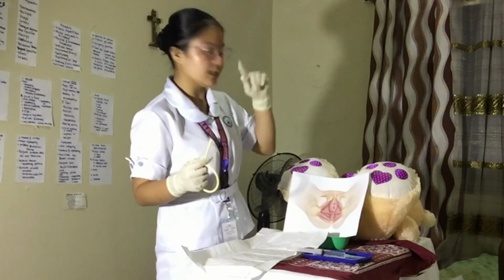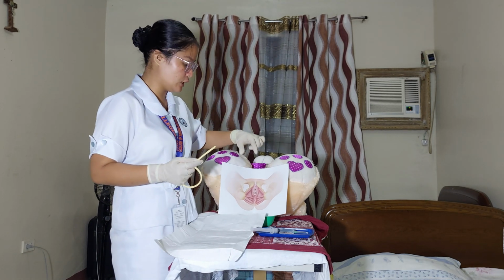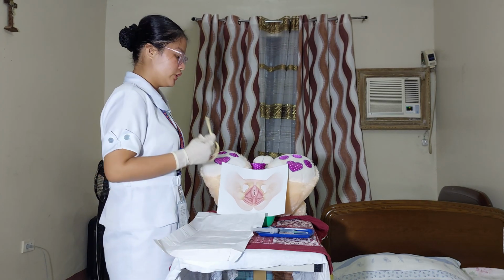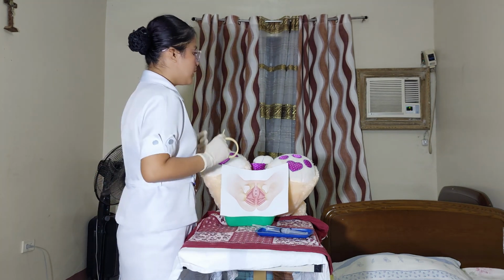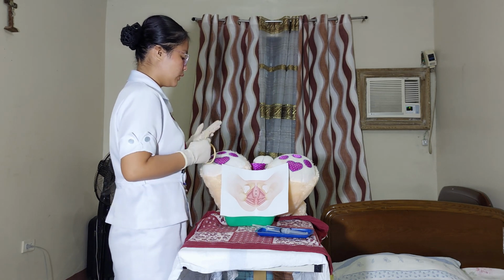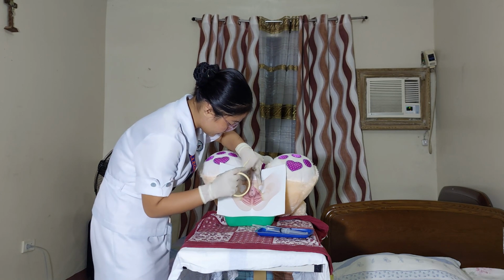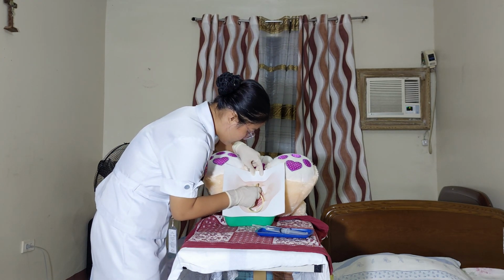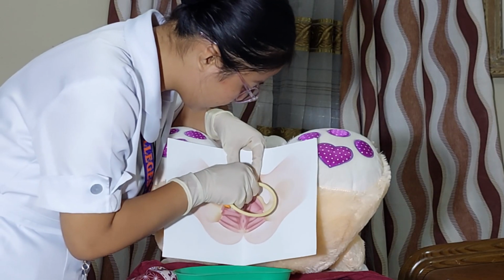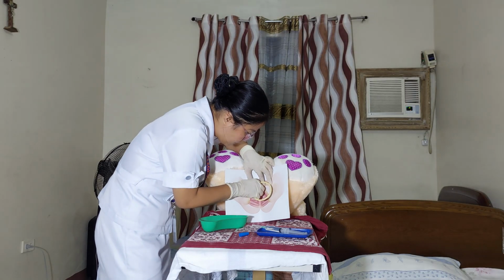So para gawin yun is now I'm going to use my non-dominant hand so I can have a better visualization of my patient's meatus. Mag-insert na po ako ng urinary catheter. So sabihan niyo po ako kung masakit po para patulungan ko po agad kayo at mabigyan po agad natin ng lunas yung sakit. So breathe in po, breathe out po, breathe in po, breathe out po.